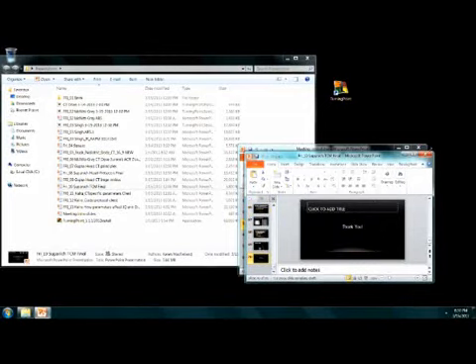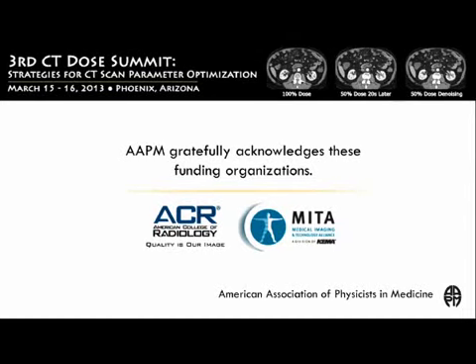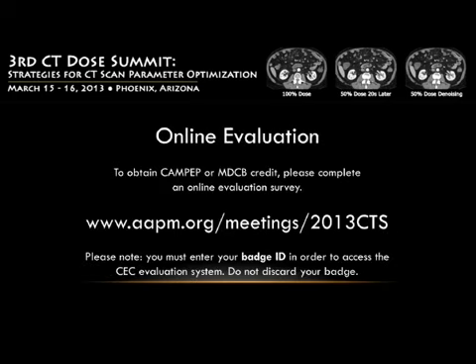Yes. I have a few comments. First of all, the comment pertains to the display of AEC settings on the PACS. Our PACS, which is an AGFA PACS, does display noise index levels. It was not the easiest thing to do in the world. You have to figure out what the DICOM structured ID for that is. Then you have to go to your PACS vendor and talk to them several times to convince them, who have no physics or clinical background, that it is important to be displayed, and it will happen. If it can happen in our AGFA PACS, which we don't regard very highly, it can happen for you also.